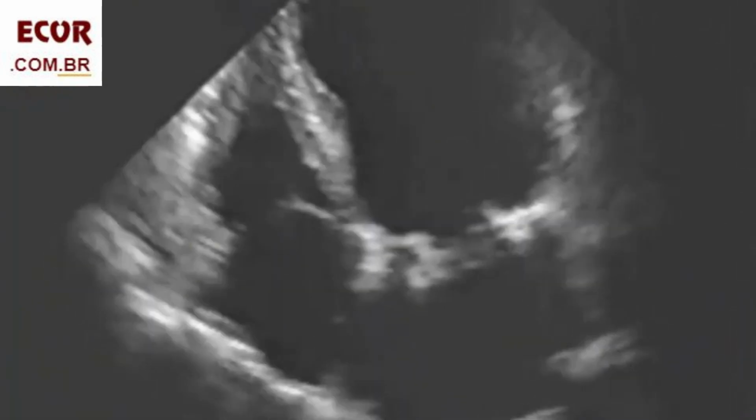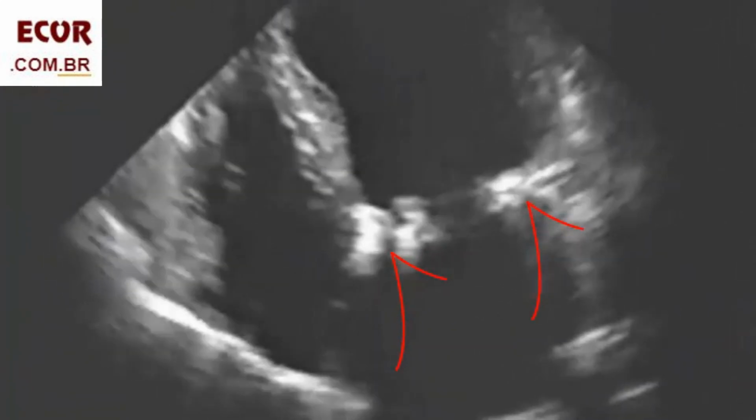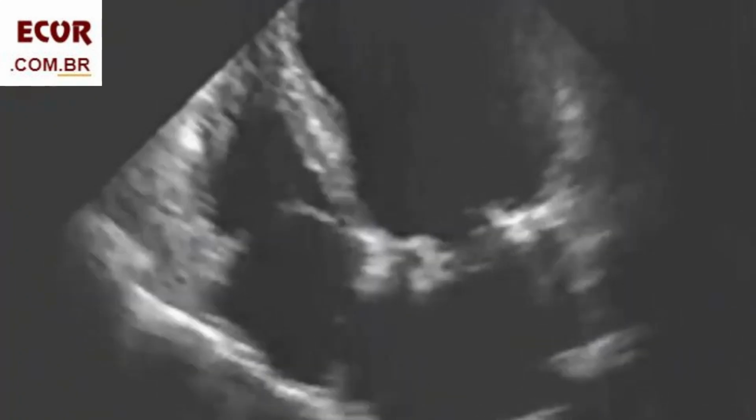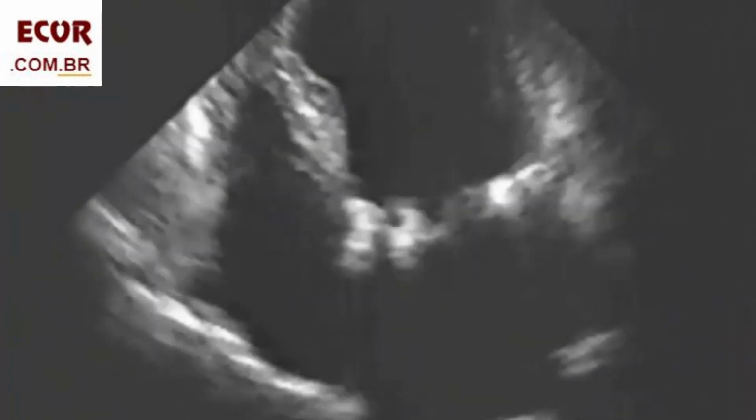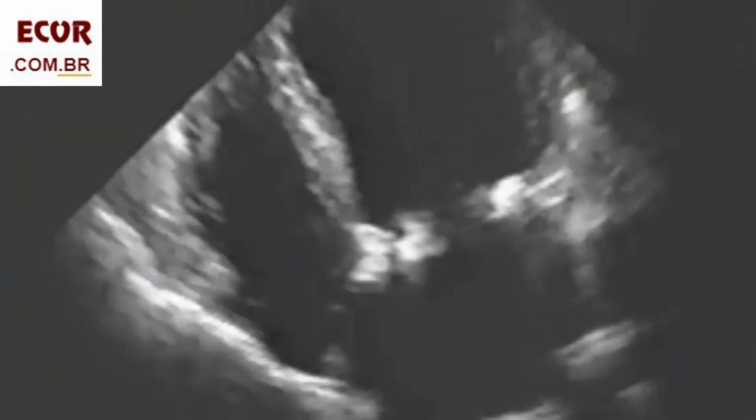Look at this case, a bioprosthesis with probable dehiscence, both at the medial and lateral regions of the sewing ring. Both sides are not moving together with the walls. But there is also something here at the leaflet that shows the possibility of vegetation or endocarditis.